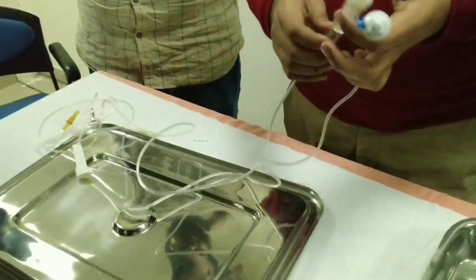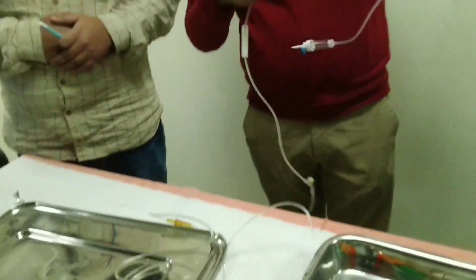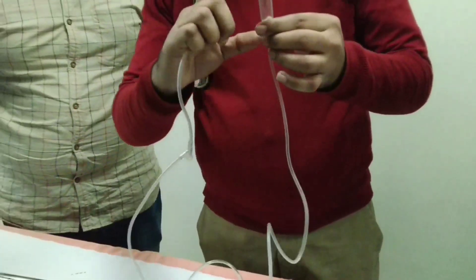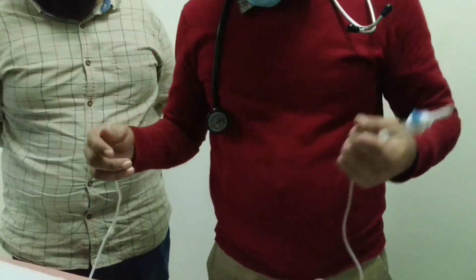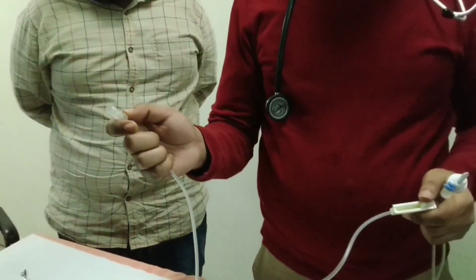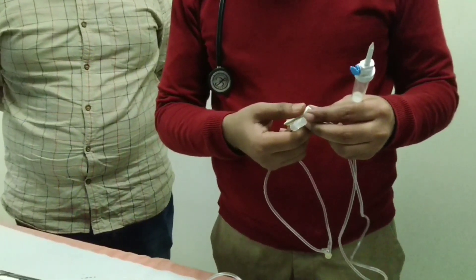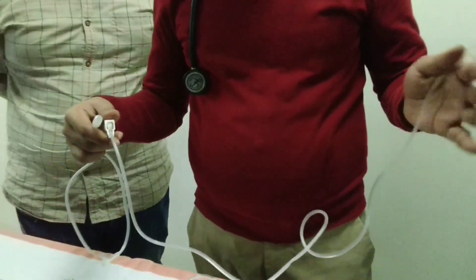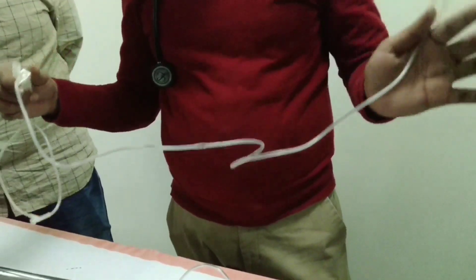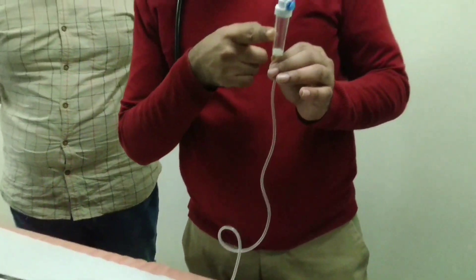This is the infusion set. It has several parts: plastic tubing, a needle, and Murphy's chamber. This is the venous catheter end and this is the controller. These are the parts of the infusion set. Why I am saying this is the infusion set is because Murphy's chamber does not have a filter.